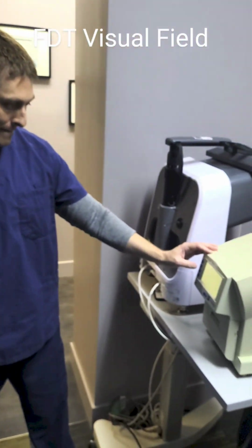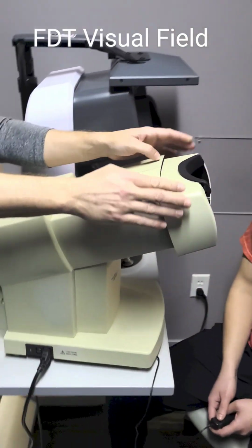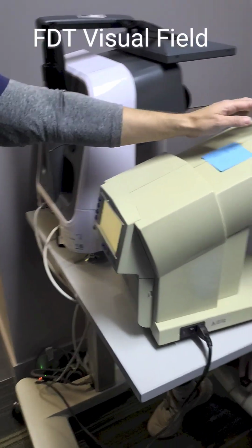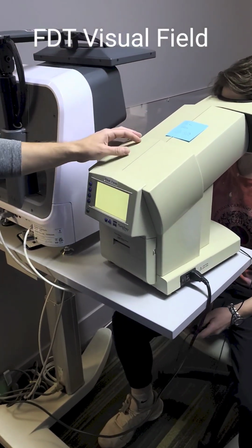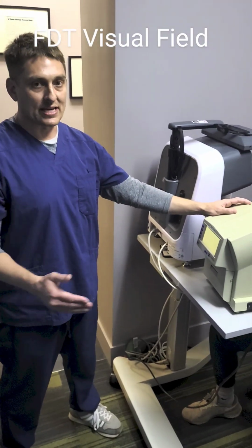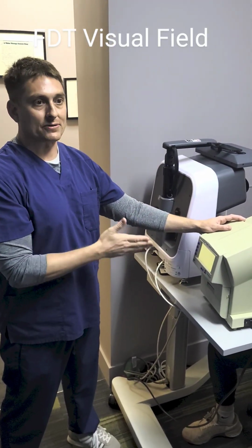Hit that button. And when you're testing the patient's right eye, slide this eyepiece over to your right. And then the machine will begin calibrating. Instruct the patient to put their forehead here and to hit the button when they see a flickering white and black lines. The white and black lines will actually appear in 17 to 19 different locations in their field of vision. The patient must look at the center black square.